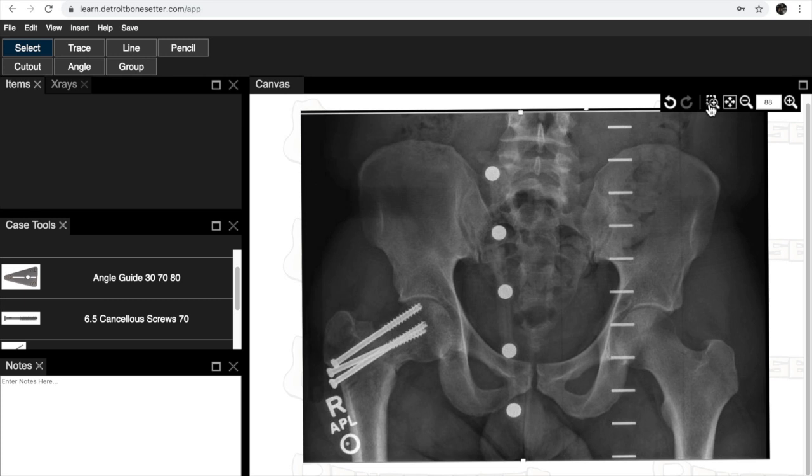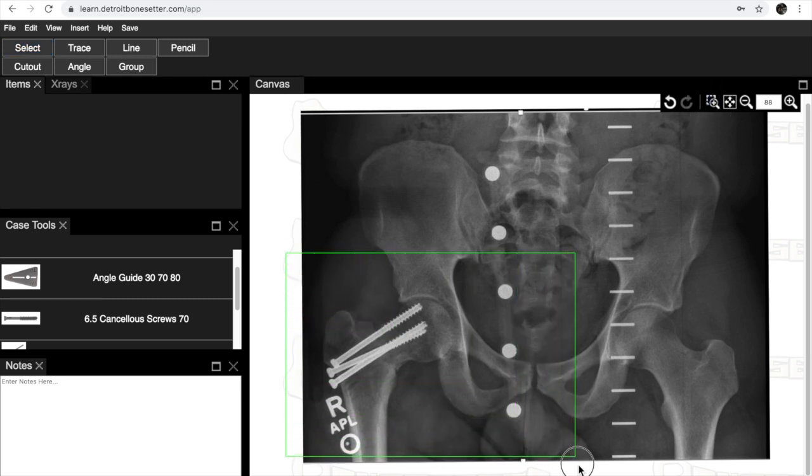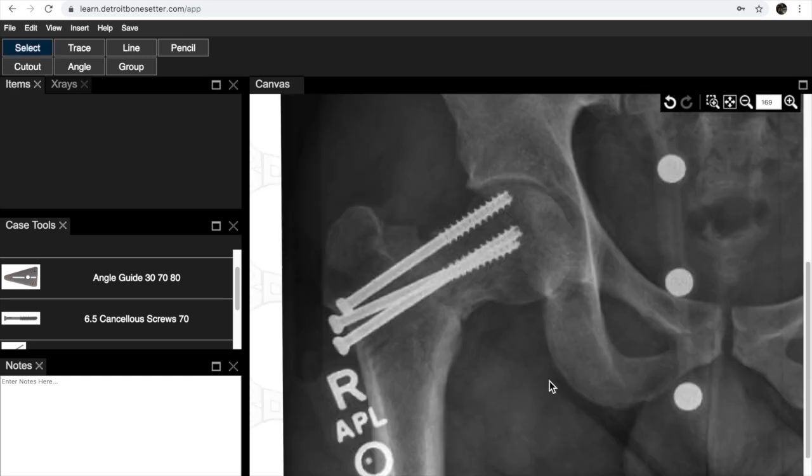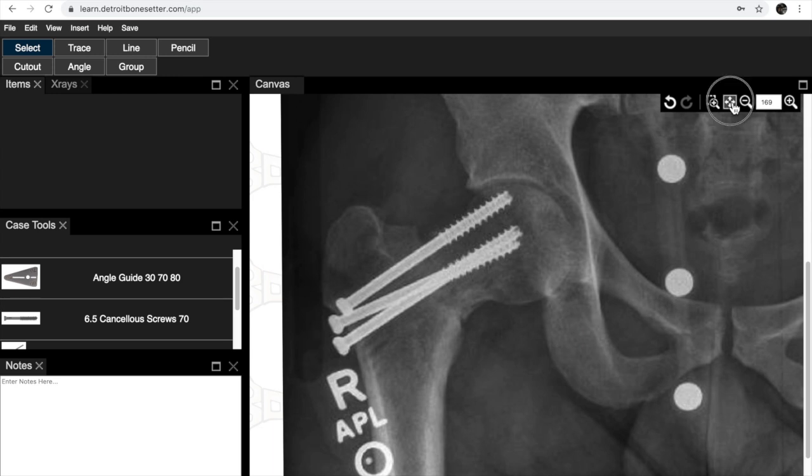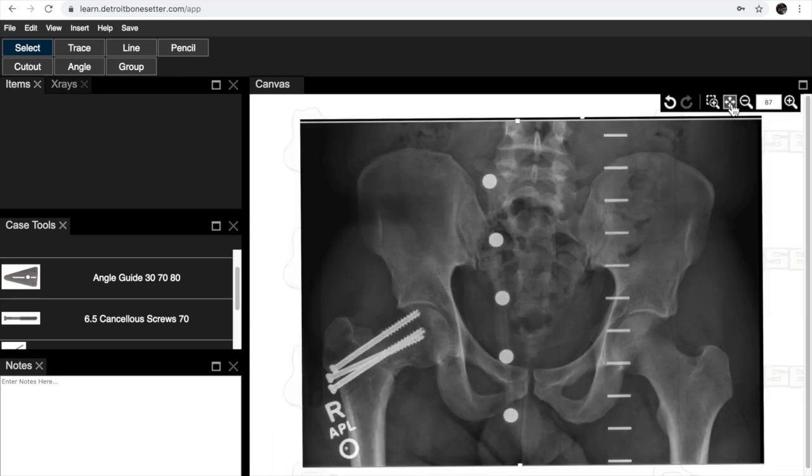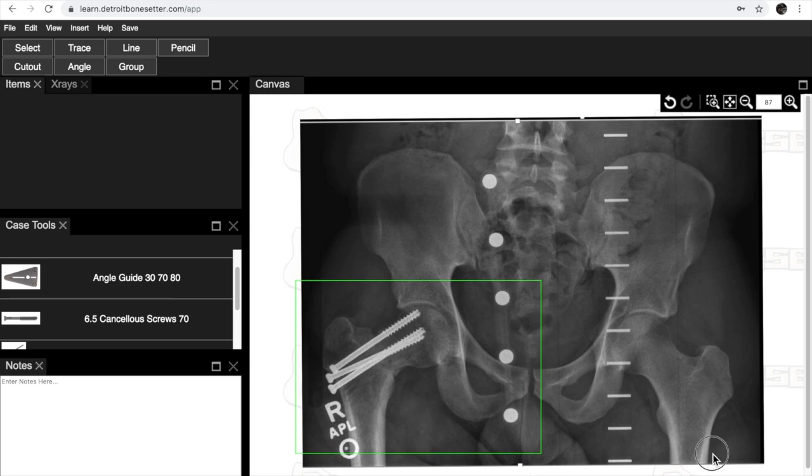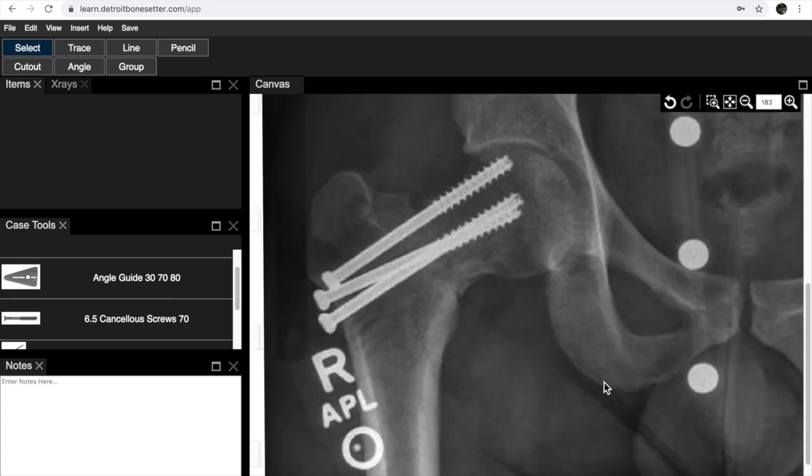The next thing we're going to show you how to do is to blow up the screen a little bit. That's with the magnify tool. You can focus in on an area and then to go back, it's the cross tool over here. You can see the fractured side.